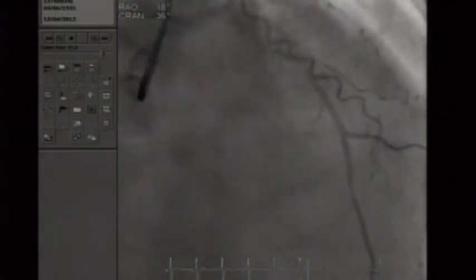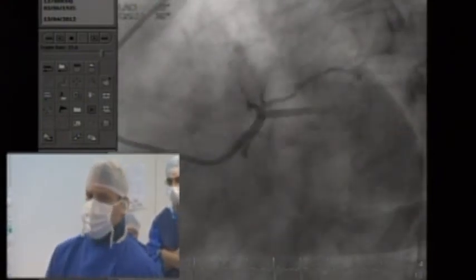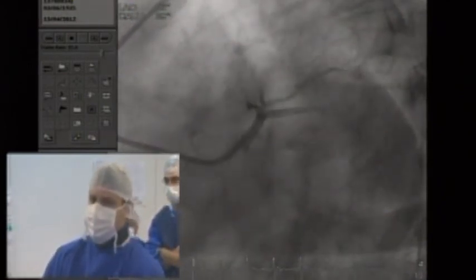Okay, basically, the coronary angiography she performed was like 6 months before, so we were afraid that something would have changed, but what we see is basically what it figured out in September. So a very severe lesion in the LAD, in the proximal, and then a focal lesion from the mid-distal portion. And if you could just move forward. And here you can see the lesion is in the intermedius and in the circ.